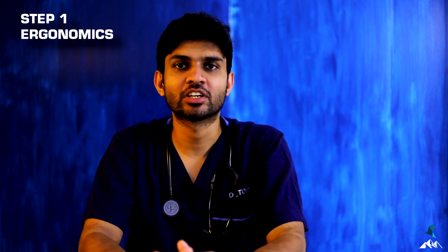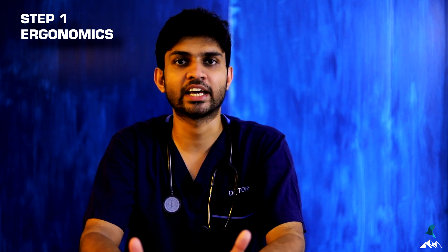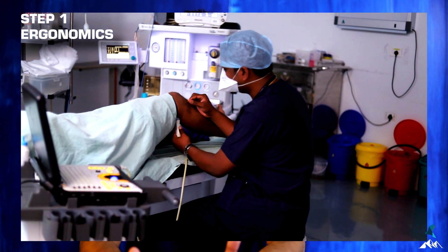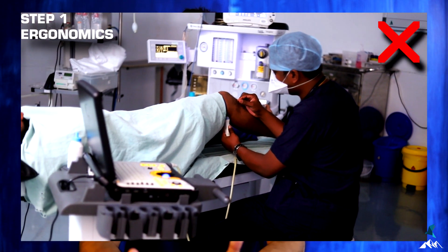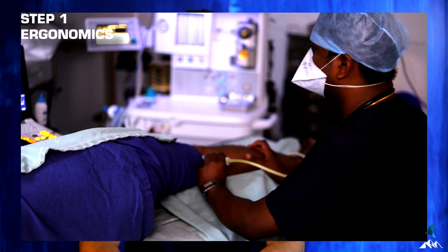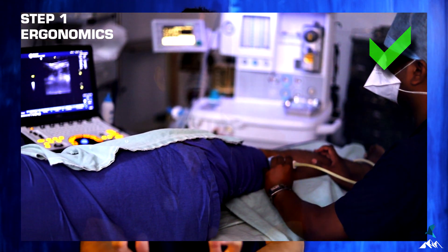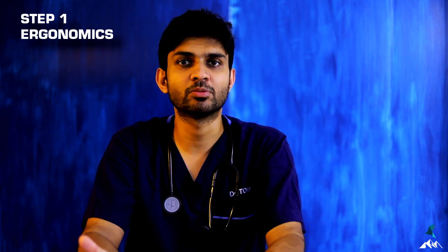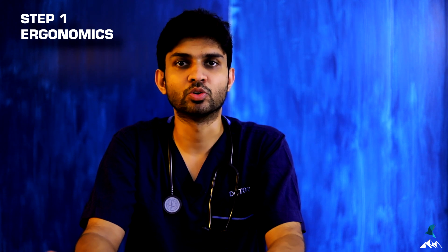The first step in doing an ultrasound guided block is to follow ergonomics. It should be arranged so that you, the part of the patient you're scanning, and the machine are in a straight line. Hand movements should be minimal — you should not be turning your head. When you work with ease there is less fatigue, you can do the procedure with more patients, and the outcome will be good.